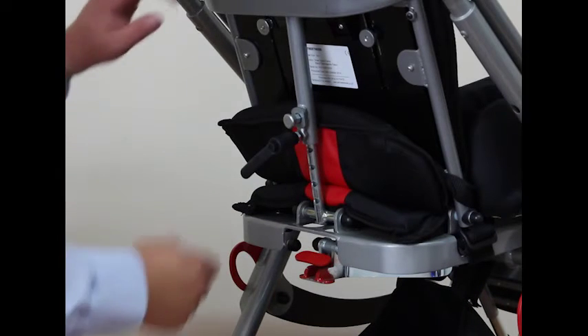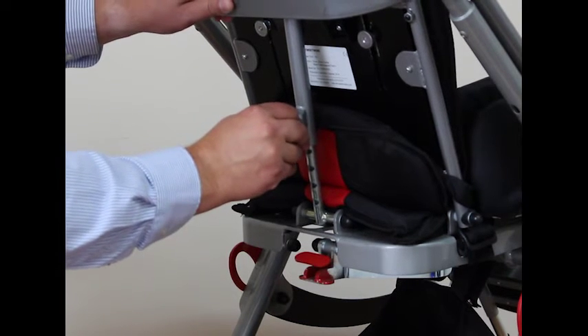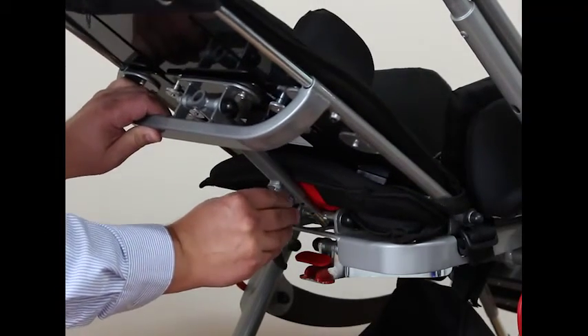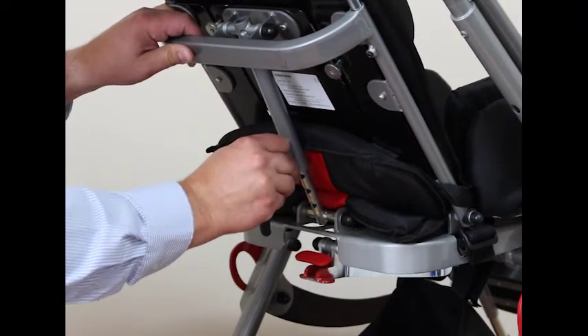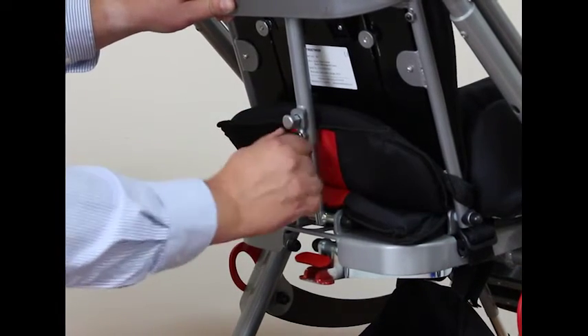The recline mechanism is also located here. Turn the lever handle three to four turns to release the lock and then use the pin to locate in the various hole settings in the backrest recline. This is especially useful for children who are tube fed, as it enables them to accommodate feeding much more conveniently. When set, lock in position.